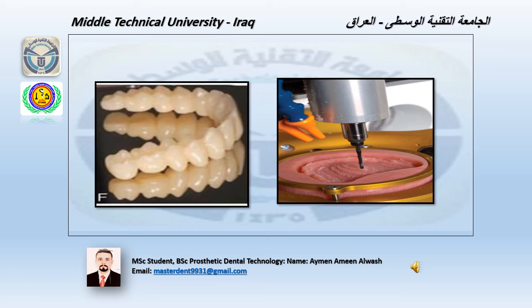This picture in this slide explains milling for the fabricated denture base by using a pink blank of acrylic, and using another blank to fabricate the dental arch. After completing milling, we bond the dentition to the denture base by using cold cure acrylic resin or chemical bonding.